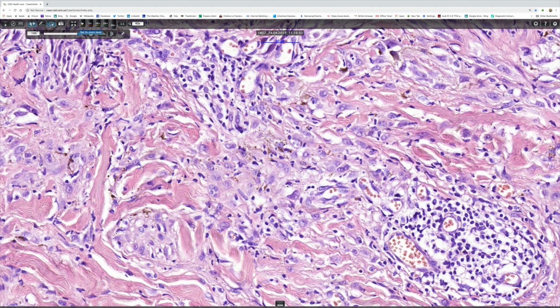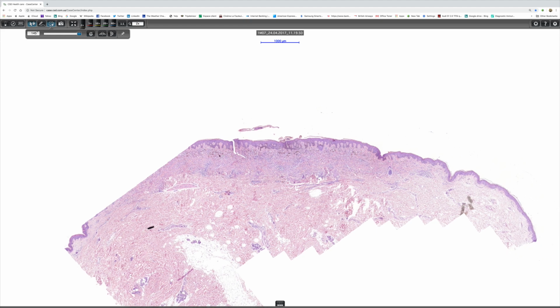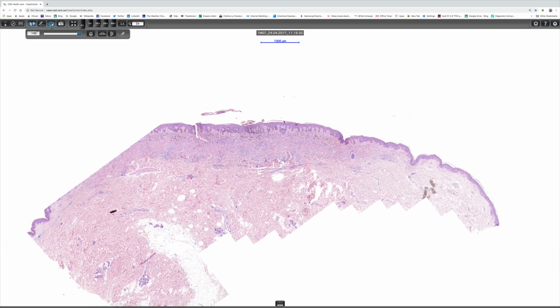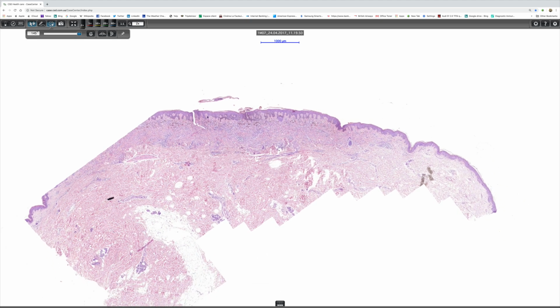Now I'm just going to go back down to the ×2. No, I don't think we can really go for a pyramidal shaped lesion on the low power. It's terribly flat, but that doesn't matter. Some Spitz nevi are pyramidal with the base uppermost, and some of them are rather flat, and I suppose this one falls into that category.